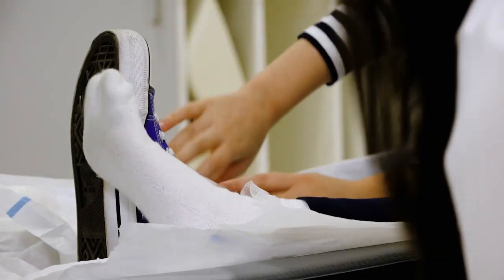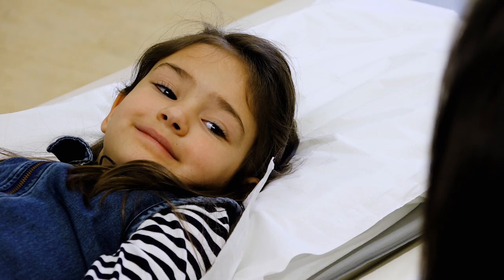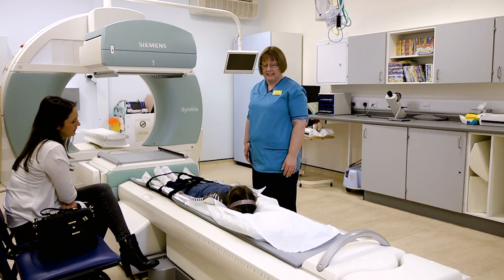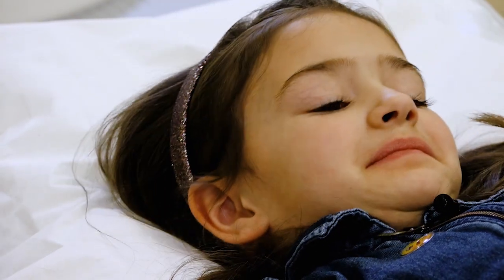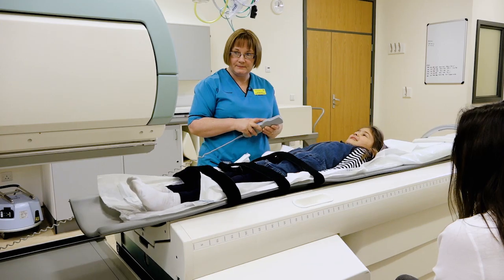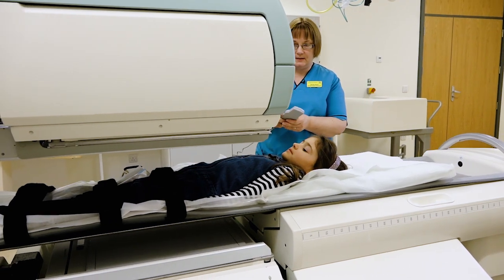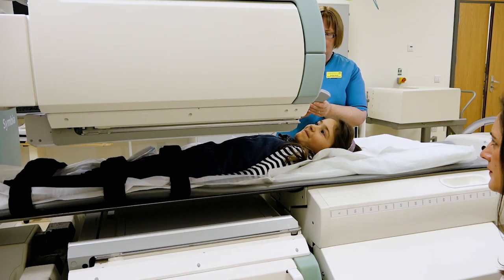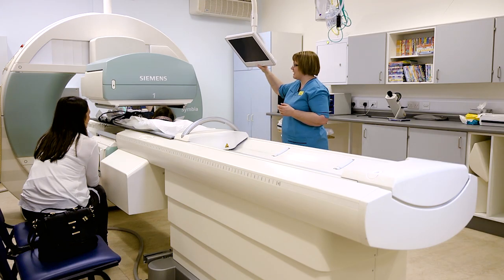The next thing is to take your shoes off and we'll get you up on the table to show what happens when we're actually taking the scan. Put your hands down by your sides and we'll just put some safety straps on. How long is it going to take? The first scan takes between six to eight minutes, then we change the camera into a different position and it takes another six to eight minutes. At the end, if the child's very very still, we do what's called a 3D scan and that takes 25 minutes. The table's going to come up high, then the camera comes very close to you but won't actually touch you. Your DVD will come up on this screen and you can just watch that.